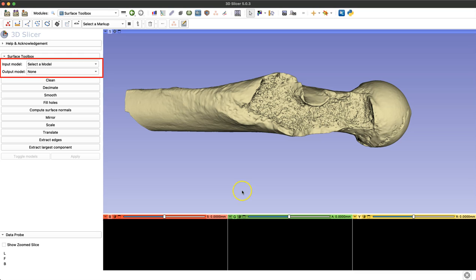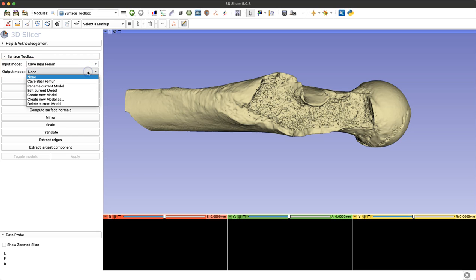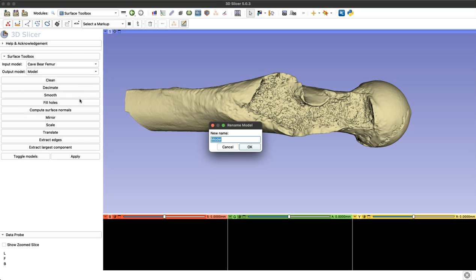Now that we're in that module, under input model I'm going to select the cave bear femur. This is the model I want to make smaller, and under output I'll select create new model as and just give it a distinctive name.